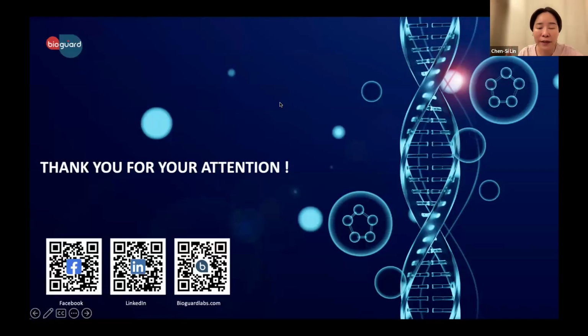But just as I mentioned in the slides, if we have our own small machine, the microfluidic-based AST machine, you only need to spend maybe just 6 hours, and you can get the result of which antibiotics the bacteria are sensitive to. So if you have this kind of machine, you don't need to spend a lot of time, and you don't need another person. You just put your sample into the microfluidic-based machine, and then you can get the result after 6 hours, and the result will tell you the proper antibiotic you should use.